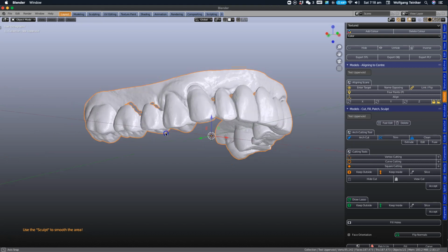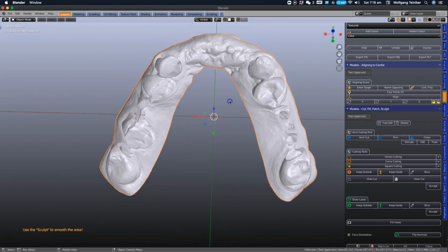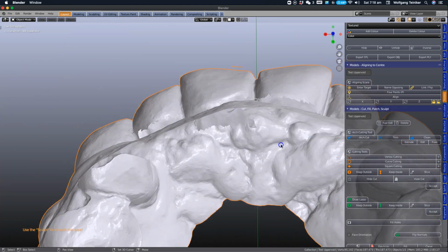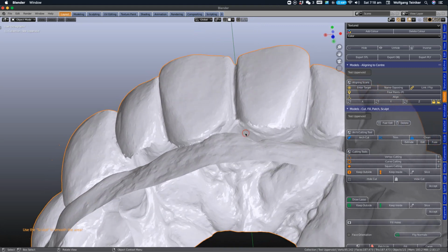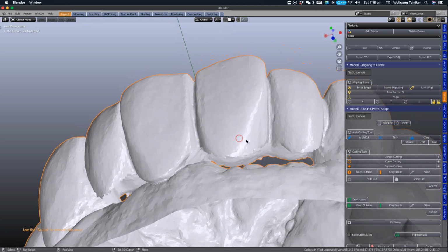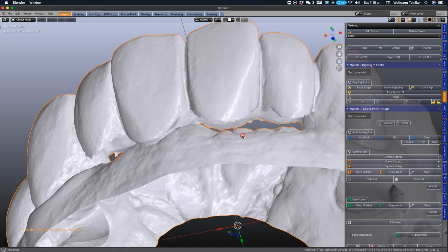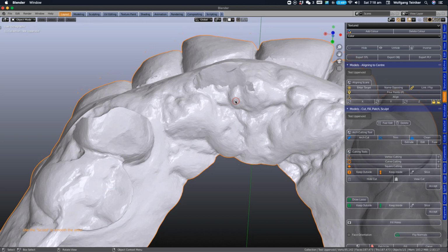Yeah, so this is a very interesting case because we have several things happening. There are holes in the mesh of the gum, but also the fitting surfaces of the pontics seem to not connect onto the gum anyways. So there's various difficulties with the case.